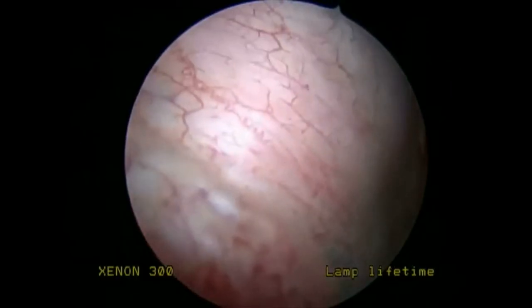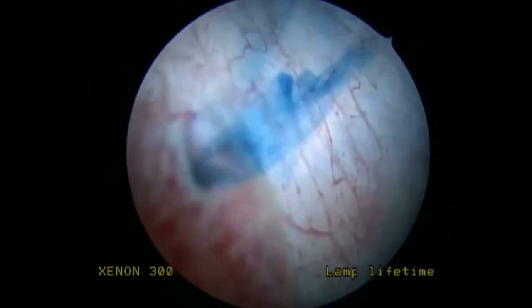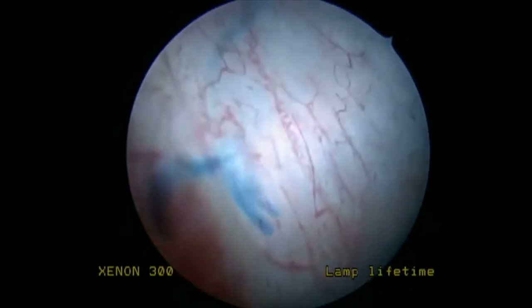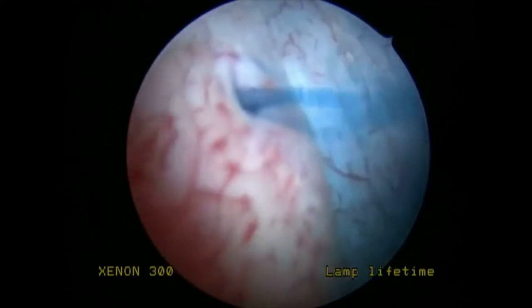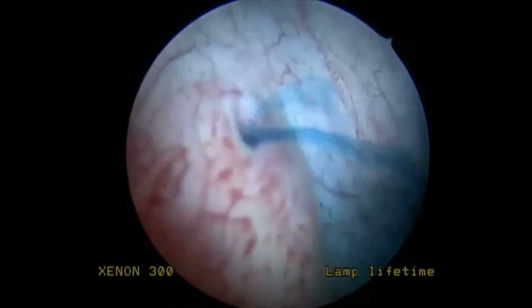This step is followed by a cystoscopy. This video was made about five or six years ago when we still used indigo carmine. Nowadays, we use pyridium, which shows orange color to the urine as it's effluxing from the ureters, and we're ensuring patency of both ureteral orifices.